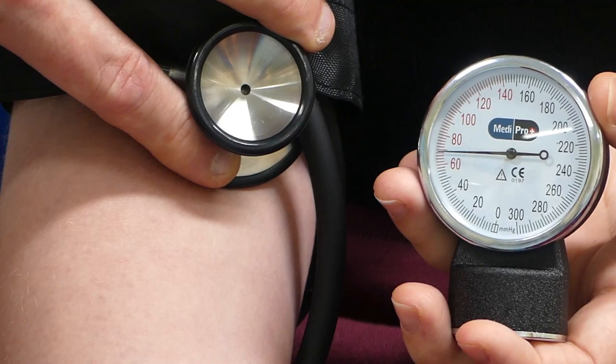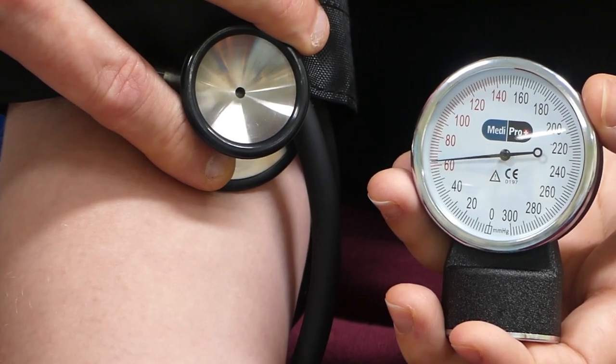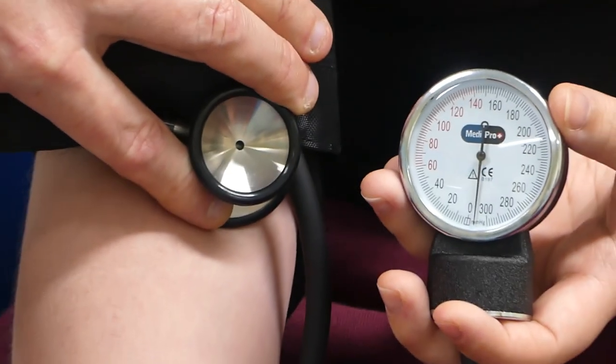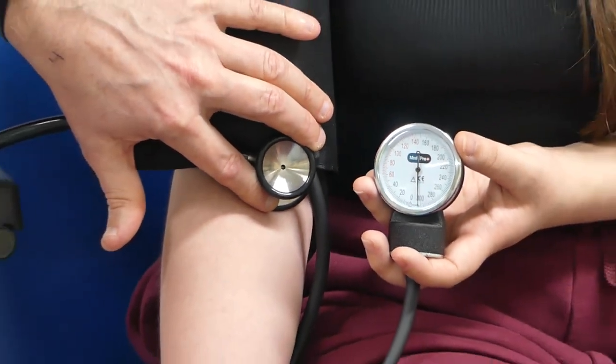The diastolic sound was coming in at about 70, just under 70. So the blood pressure is coming down during this assessment, which is good.